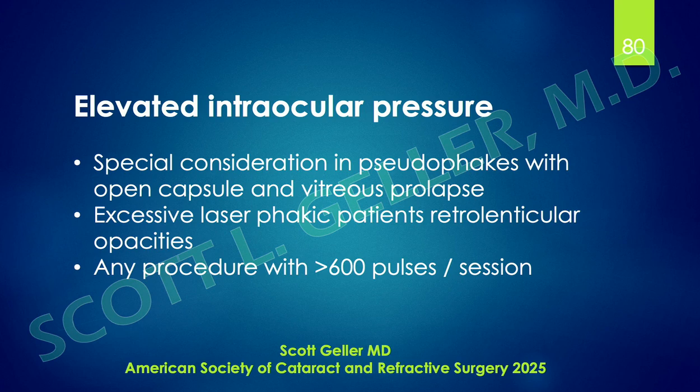Well, definitely pseudophakics with open capsules and vitreous prolapse. If you see vitreous prolapse after somebody else's capsulotomy, and there's a communication between the vitreous and the anterior chamber, it is definitely a risk factor. And what you have to do is modify your technique.